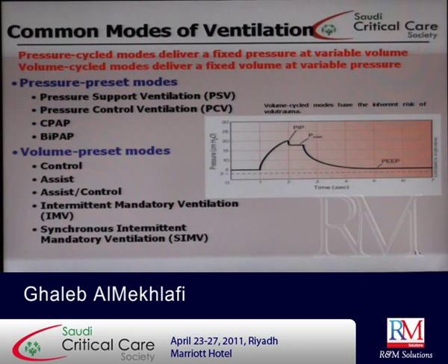The principle is that finally it is either volume, you are producing volume into the patient directly, a specific size of volume or a specific tidal volume or minute ventilation, or you are inflating the chest with pressure, and this will drive the flow. Okay, so the principle is the same.